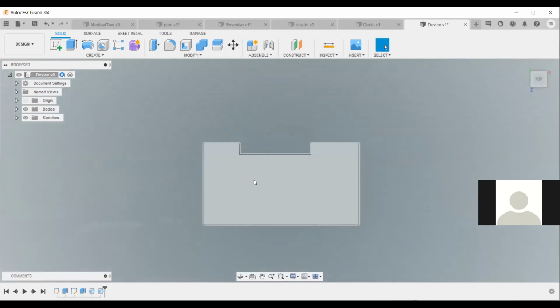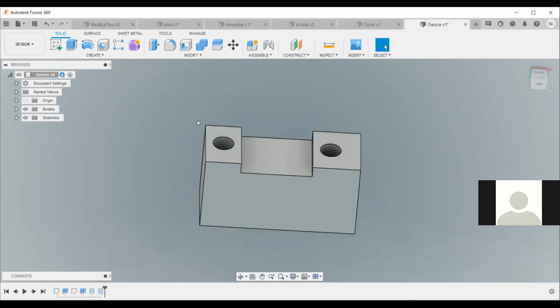So it's a very simple part. For those who did not get it, here is 10, 60. Then the whole of this was 50. So this is 10, 50, the 10, 60. Then the other one, the bottom one, I didn't label, but that is not the issue. We want to create something to fill the upper, and then we will merge them.